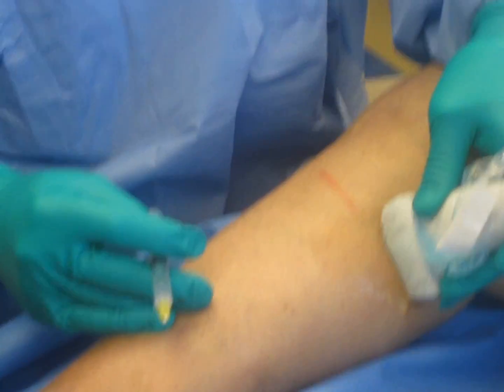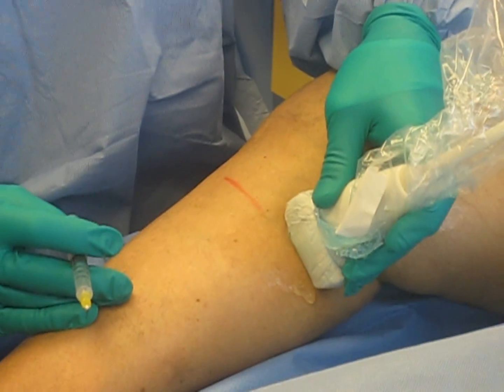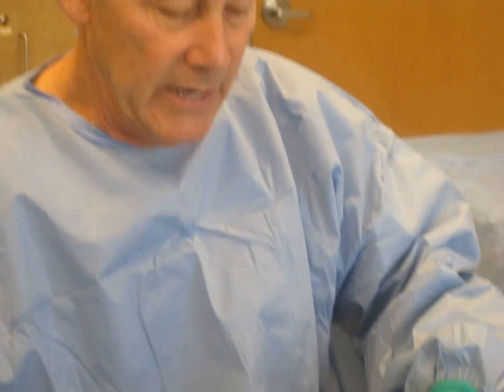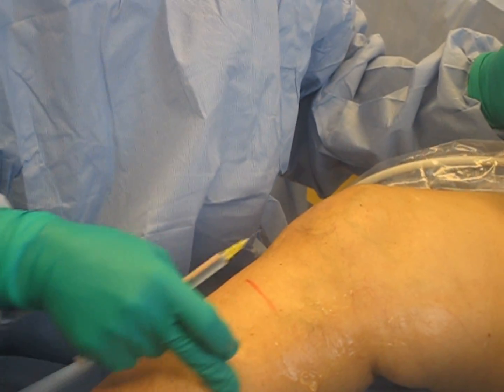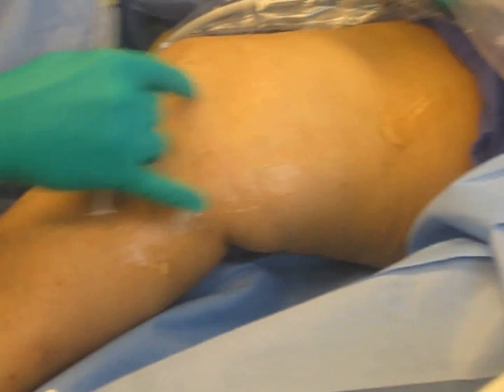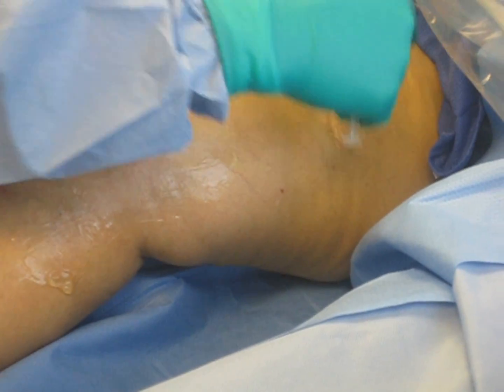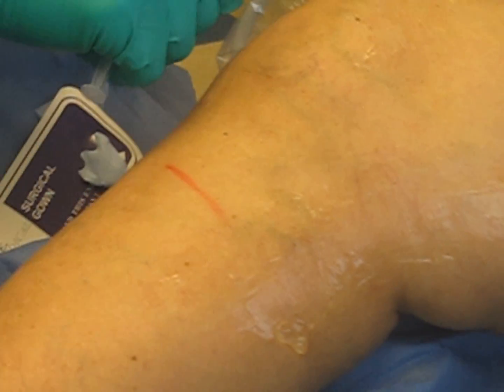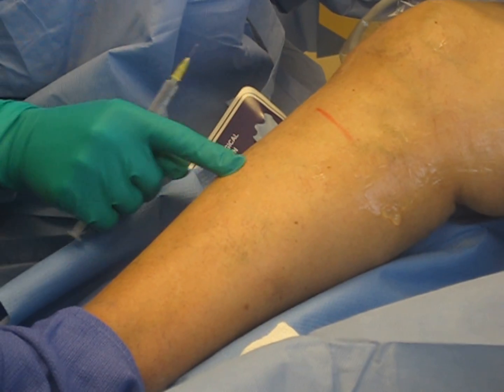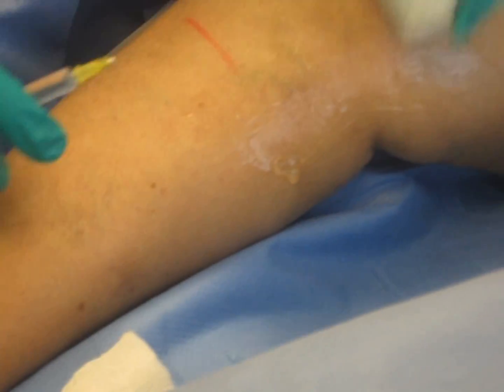We're starting our EVLT — an endovenous thermal ablation of a right great saphenous vein. The right great saphenous vein goes up the inside of the thigh; these branches feed into it and it turns into the deep vein. The valve at the junction of the superficial vein and the deep vein is broken, allowing blood to go down this leg — you can see all these little varicose veins and some skin changes starting here. So we're going to close that vein.